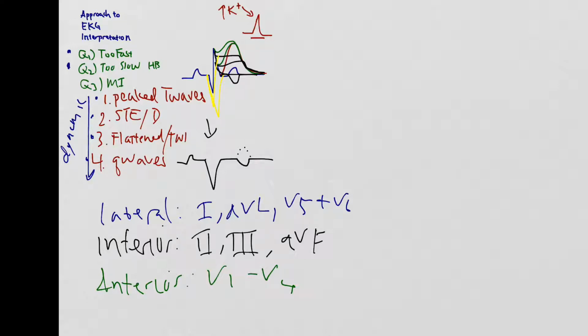It'll probably take your nurses 20 minutes to get the machine set up and to finally print you out a copy, and hopefully in that time you'll start seeing some dynamic changes if they're in fact having an acute STEMI. Don't wait the 4 hours that we usually have as a standing order when we're ruling people out for a STEMI. So now that we've gone over all of this, let's go over some examples and apply these principles.